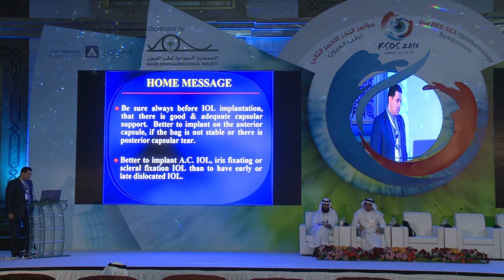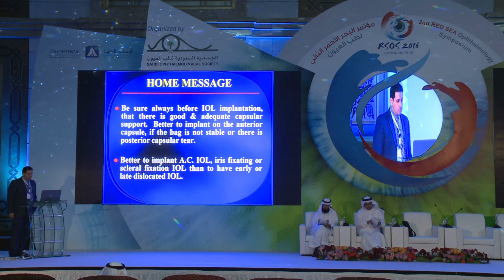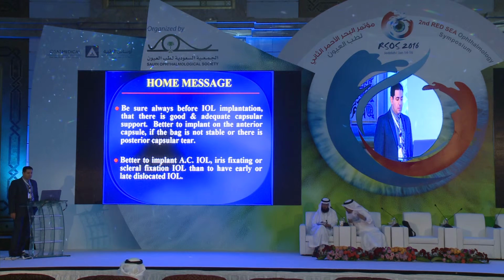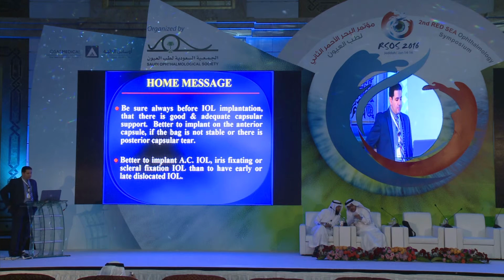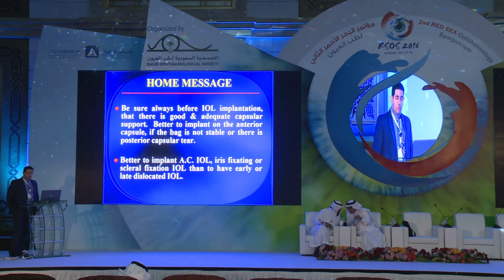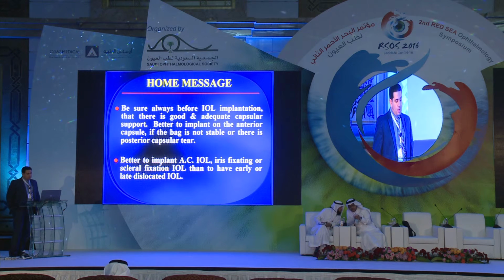What's our take-home message from this? Try to always be sure before IOL implantation that there is good and adequate capsular support. Better to implant on the anterior capsule if the bag is not stable or if there is any tear in the bag. Better to implant an anterior chamber IOL, Artisan, iris fixating, or glued IOL than to have an early or late dislocated IOL. Thank you.